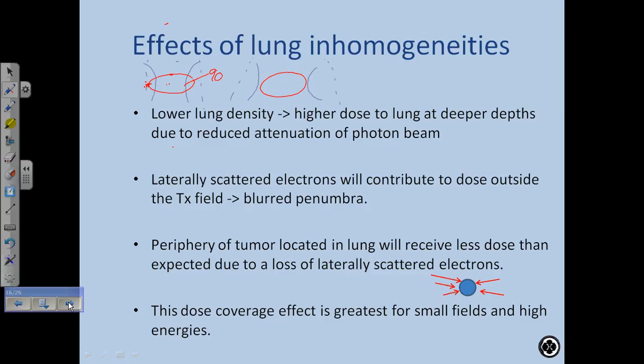The doc might say, well, 234 a day, the hotspot's in some area that's muscle, it's really resistant to radiation. I don't really care. I can do 234, but I really need to treat this tumor. So he might tolerate a really high hotspot. Anyway, that's the kind of discussion that you need to have with the doctor when you're doing treatment planning.